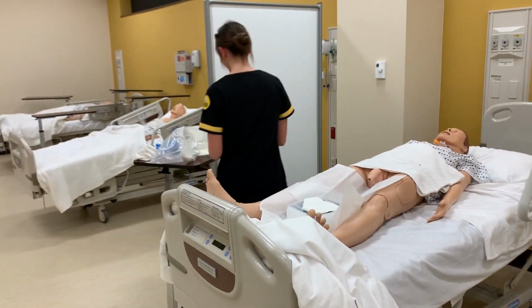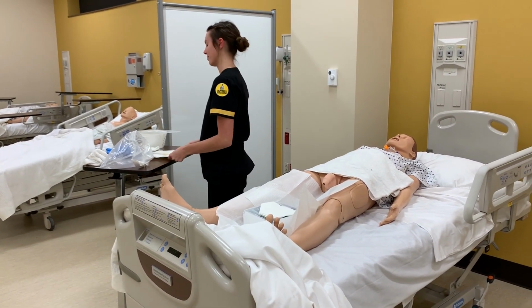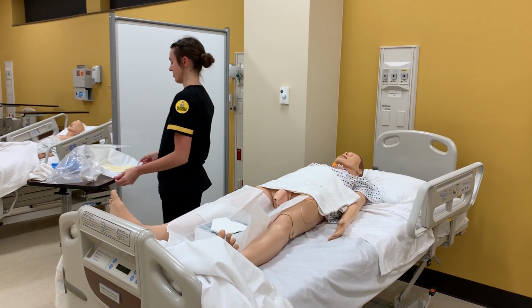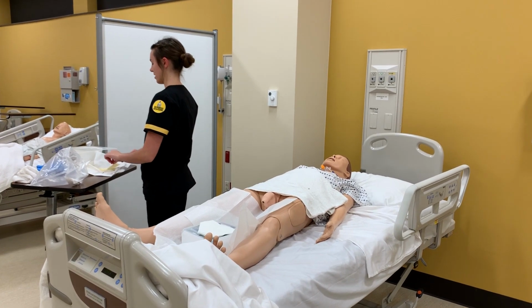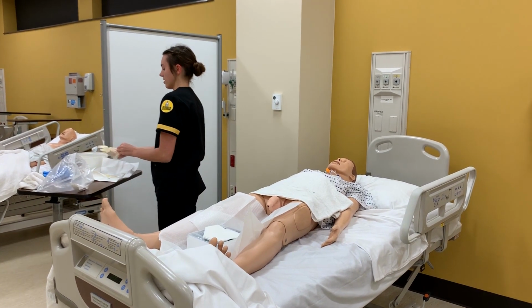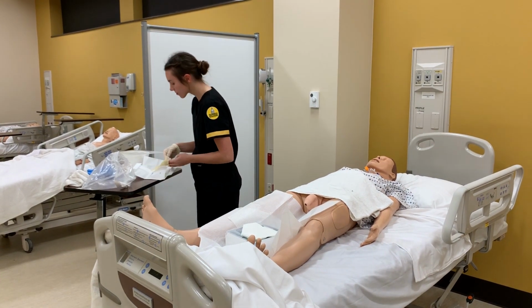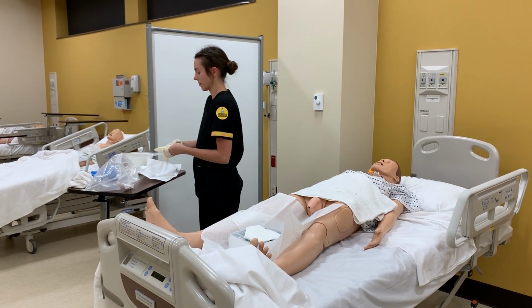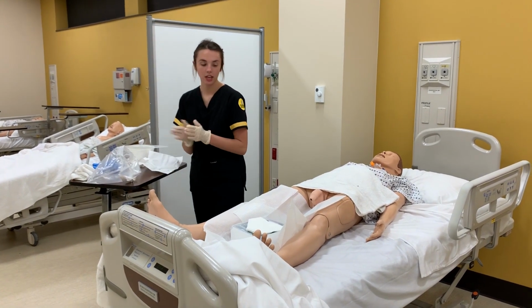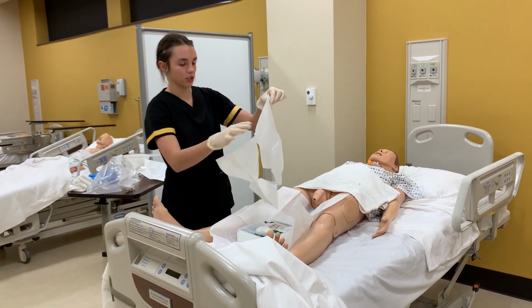We're gonna pretend those didn't happen. Okay, here we go. One more time. Now we're talking. All right. We're gonna grab it. So sorry that was so difficult. Okay, so now we have one more drape that we are going to put across here.